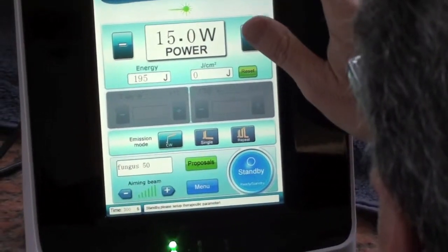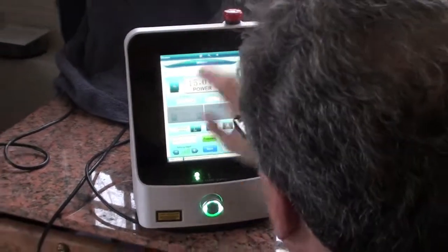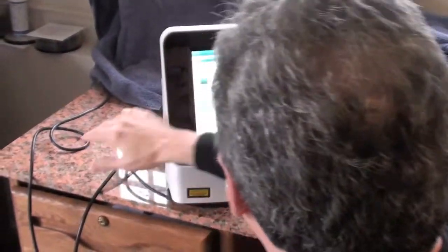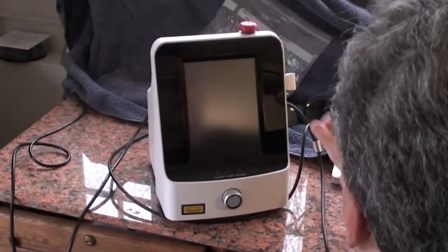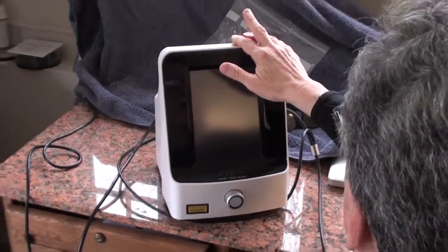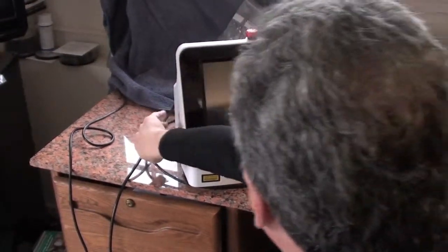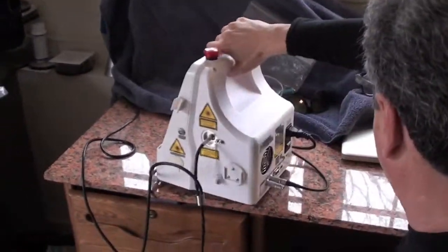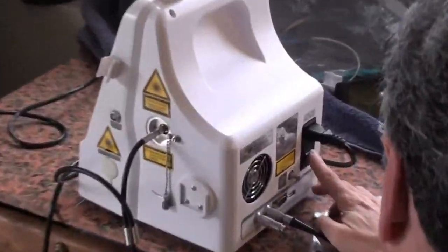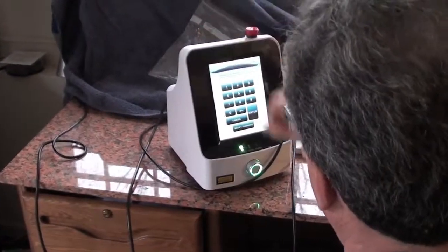When you turn this machine on and it doesn't fire up, there are 3 problems it can be. One is you don't have the button on in the back. Two is you've accidentally, if you've moved it from office to office, pushed this down. That's emergency. Do not use this switch to turn it on and off. It'll come back on, but do not use it routinely. Use the button in the back to shut it off and on. And that's that. Okay, that's it.